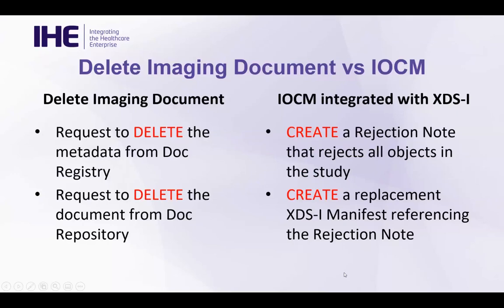For those of you familiar with the IHE radiology domain, especially on the imaging side, you probably also heard about IOCM, or Imaging Object Change Management, which is also a mechanism that allows a system, an image manager, or a change requester from the profile perspective, to communicate changes of a study to a downstream system, another image manager.